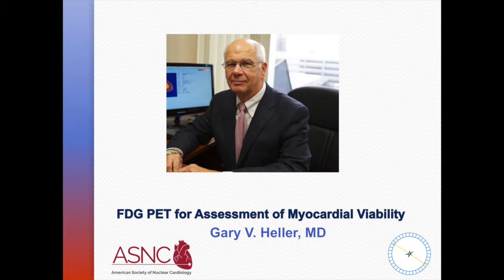Well, it's very helpful. So it sounds like in this case, before the FDG study, there were some questions as to whether the patient should have revascularization, but in this case, this was a match and therefore became a non-candidate for revascularization. So I'm assuming this was quite helpful in this particular patient's care.